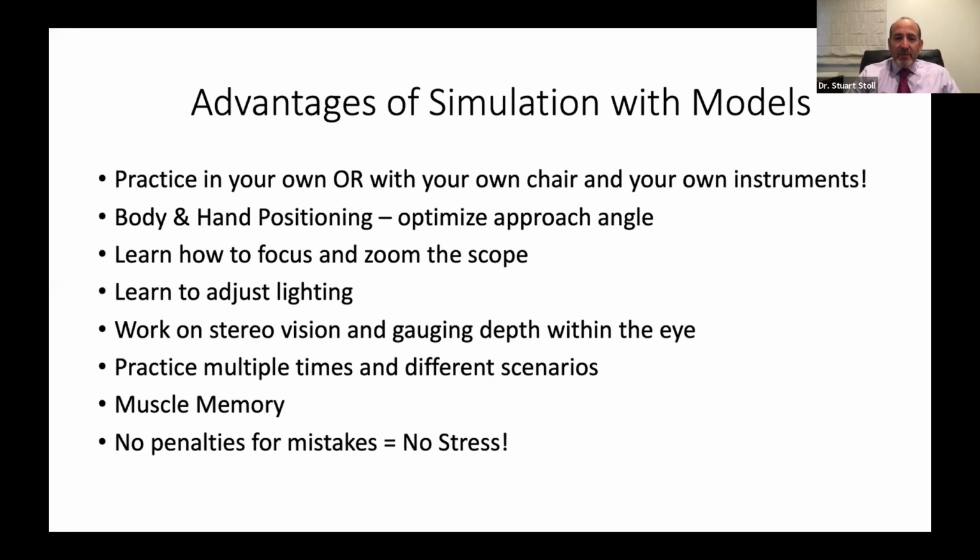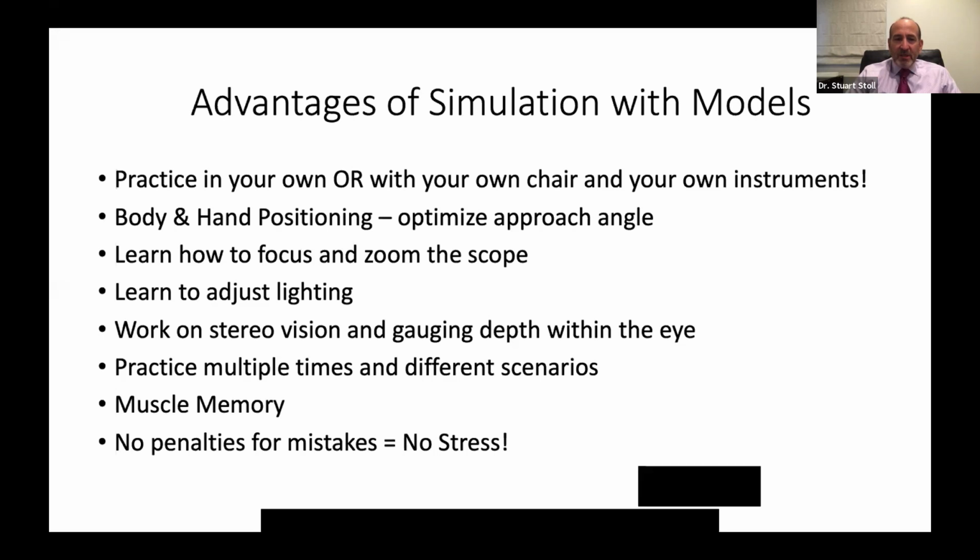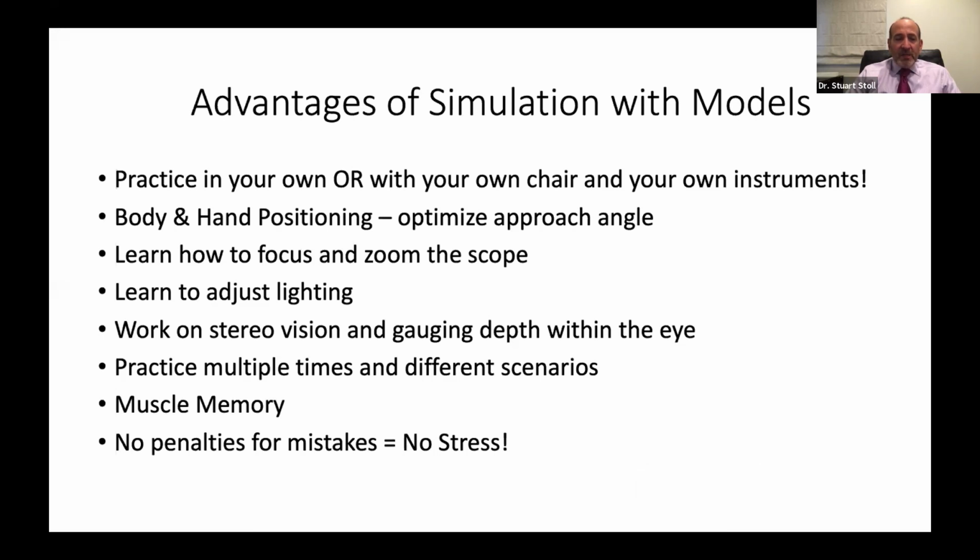So that's an advantage we have over some of the digital systems where the instruments, I find, are not that realistic, and you're not getting depth of field and focus and hand positioning as you would in the actual OR. So with the models, you can practice the body and hand positioning, you can optimize your approach angles. You're working on your actual scope, so you're going to learn how to focus, how to zoom your scope, learn that you can adjust your lighting.